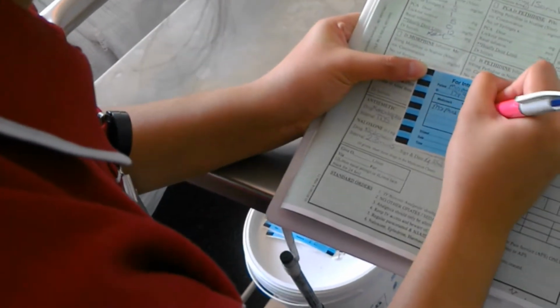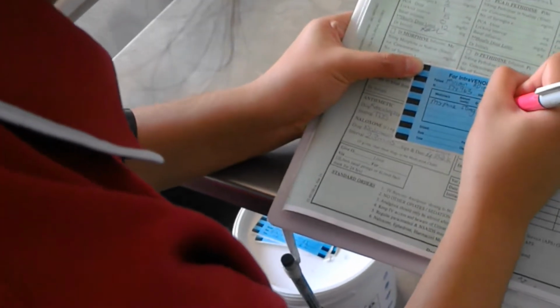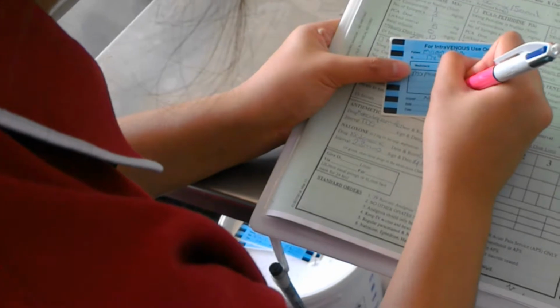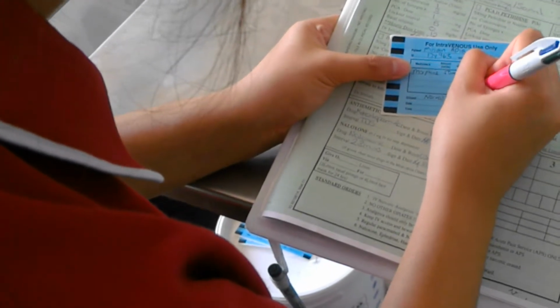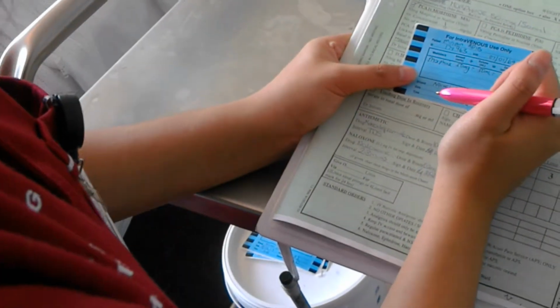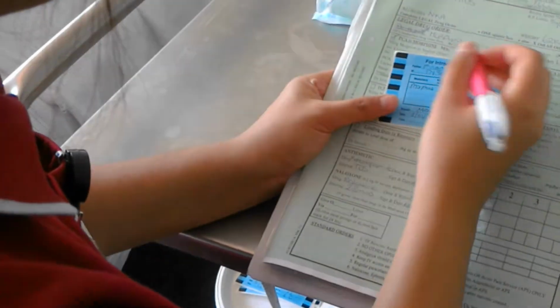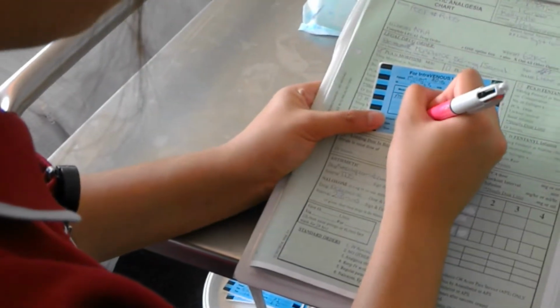Medicine is morphine. 50 milligrams in 50 mils is 1 milligram per mil. Diluent is normal saline. The date, so it's the date of when I did the video, which is the 18th of March. The time was at 1:45.